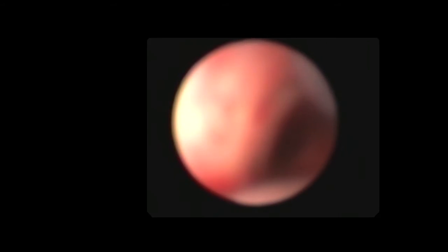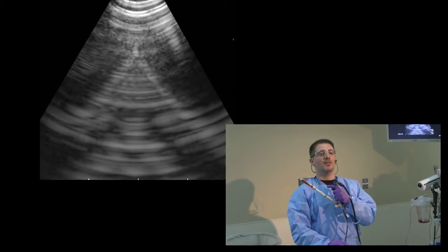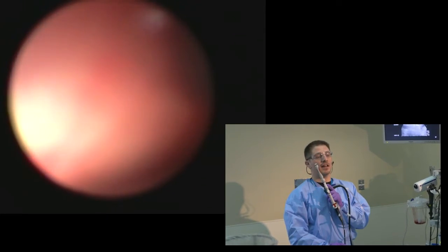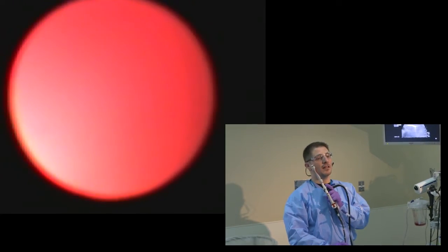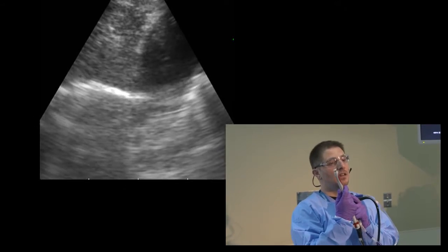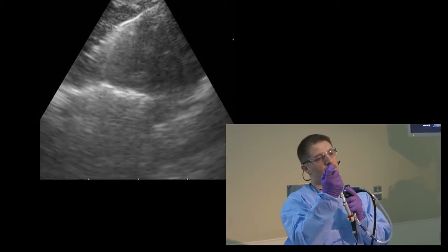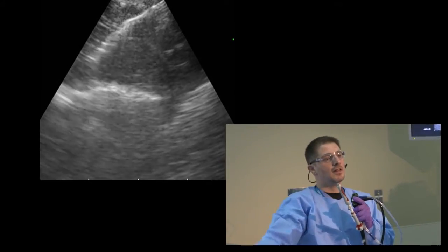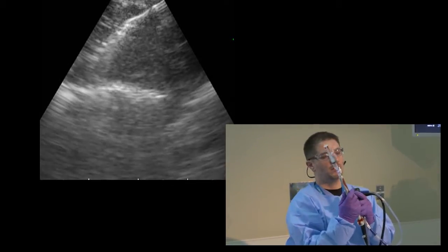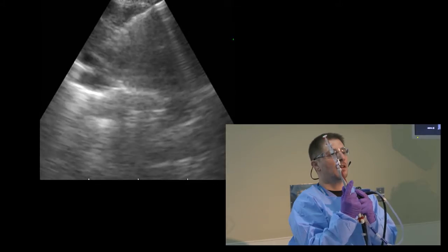You look at the sheath in the endobronchial view, set up the depth of your sample, and then drive in the right main stem, looking at the right upper lobe and the bronchus intermedius, make contact by thumbing down, and then find the lymph node and put it in the second half at the left side of the screen at this location and sample with the needle inside it. We do suction. We pull the stylet out. And we sample edge to edge as we did before.